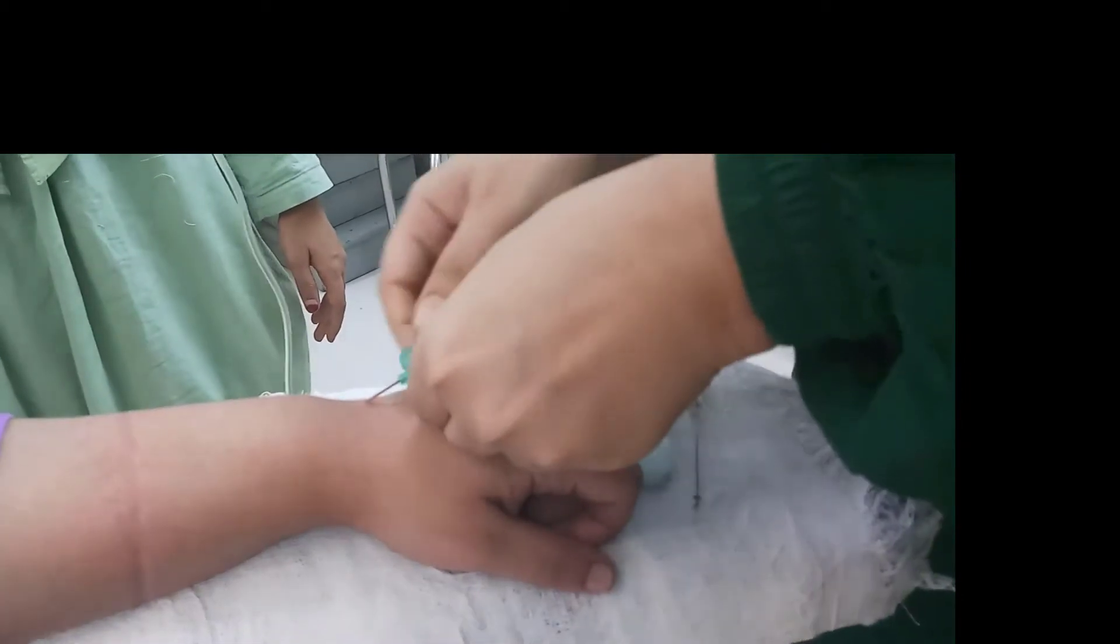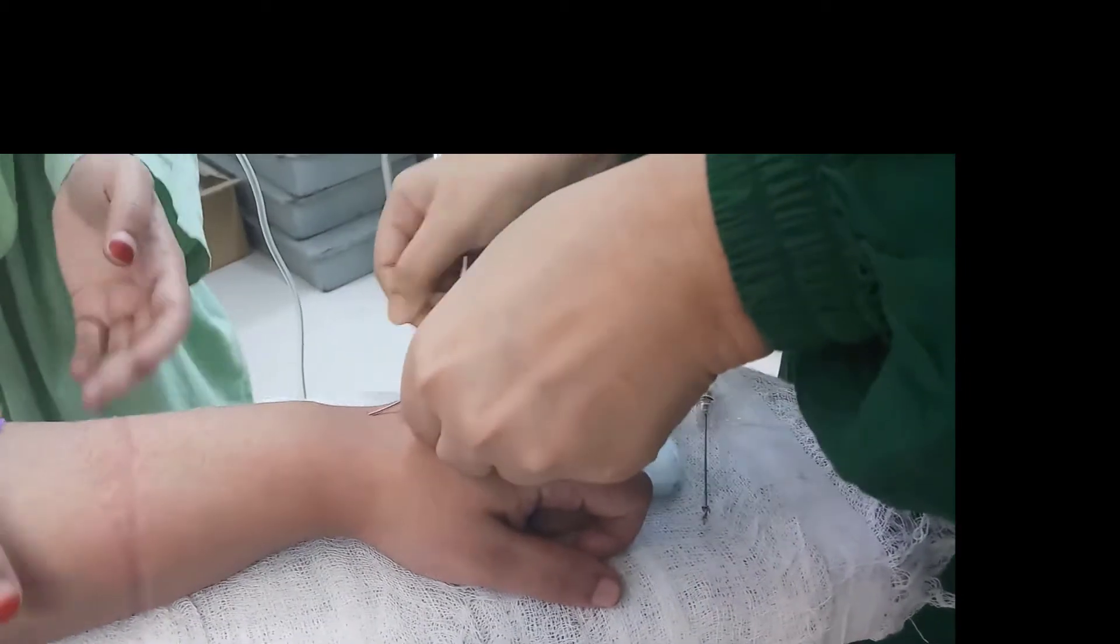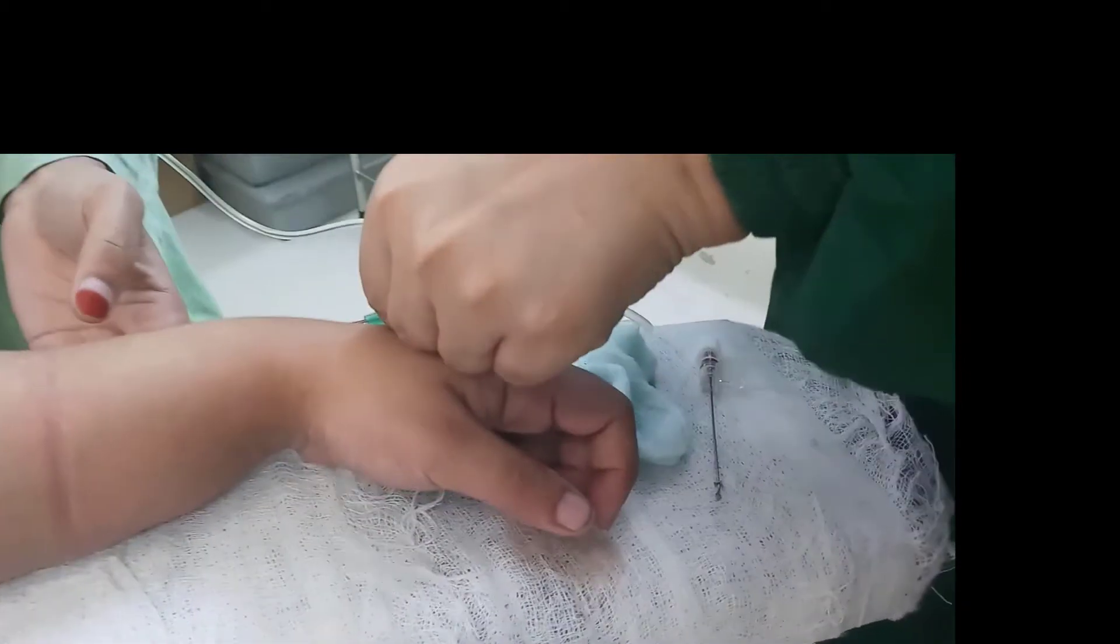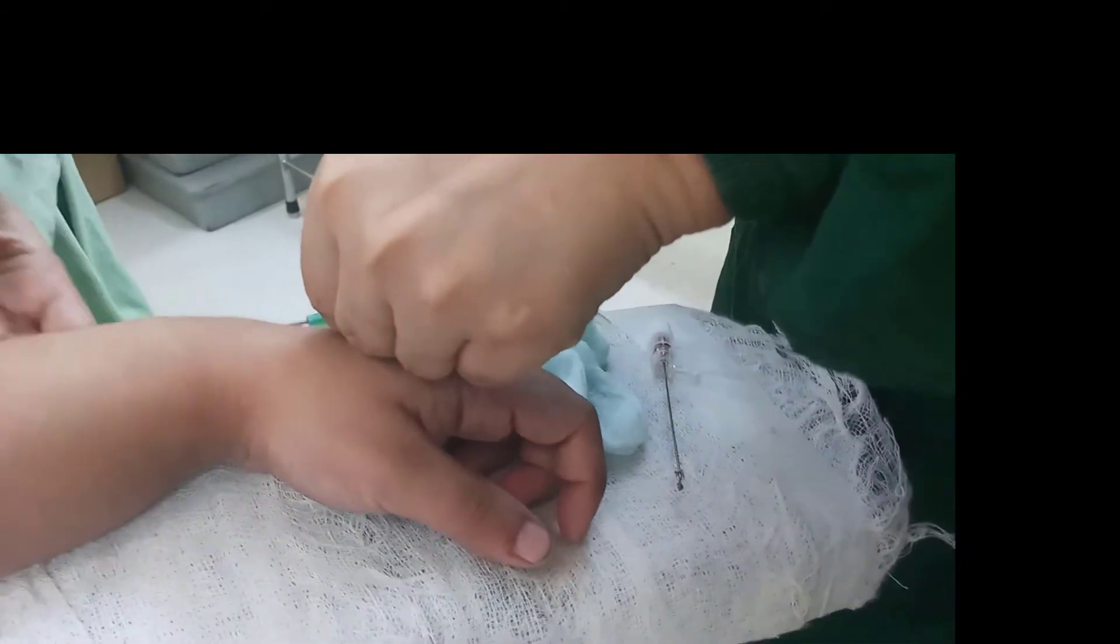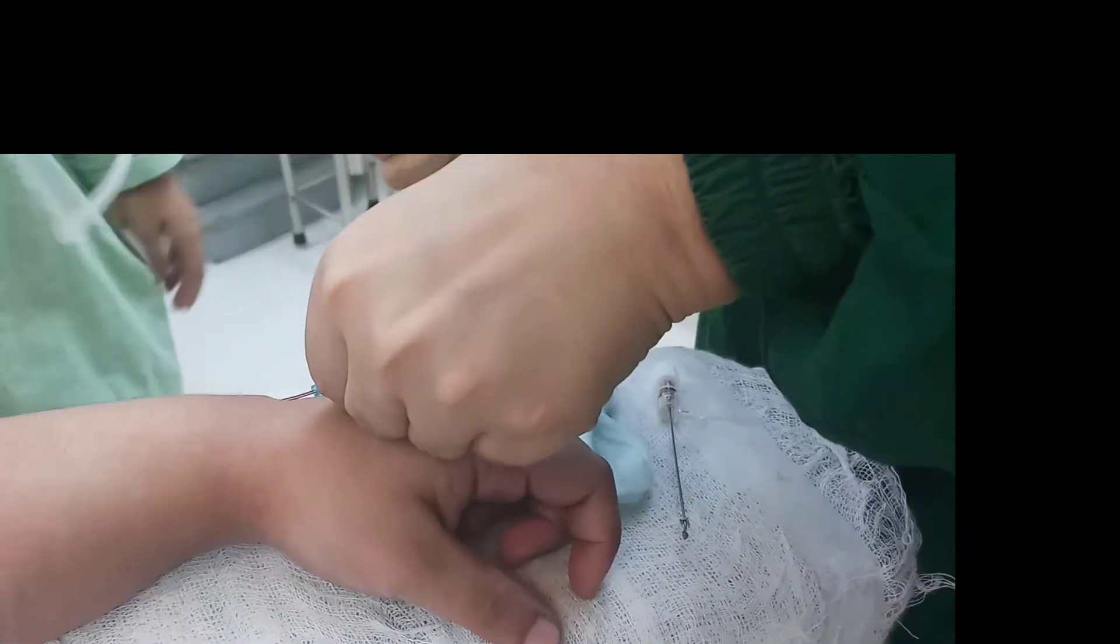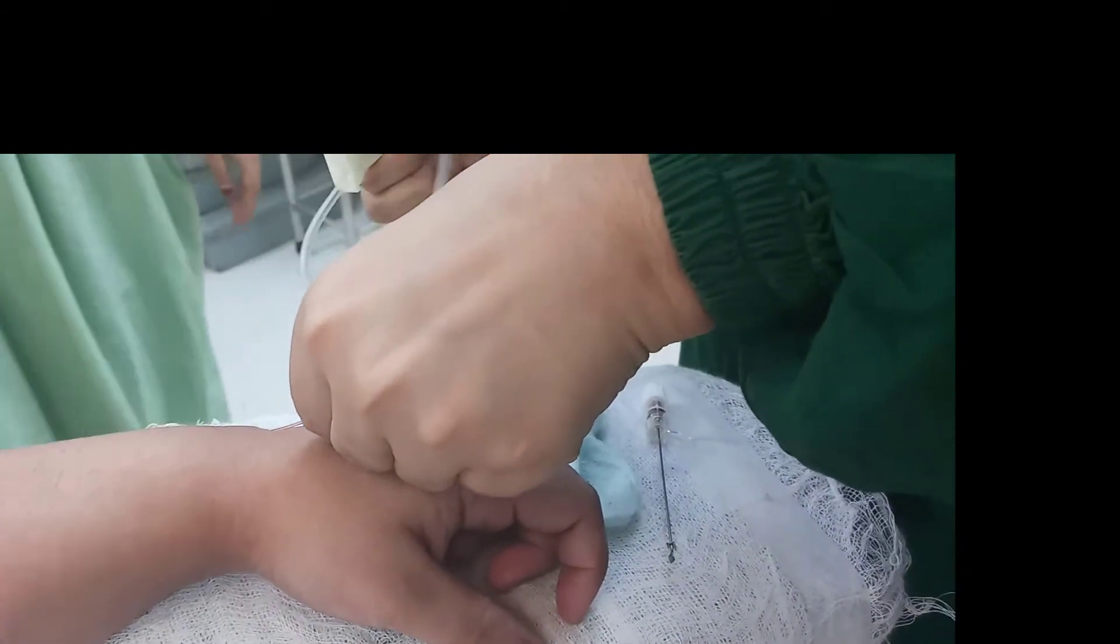Then the cannula is introduced into the vein by sliding action.